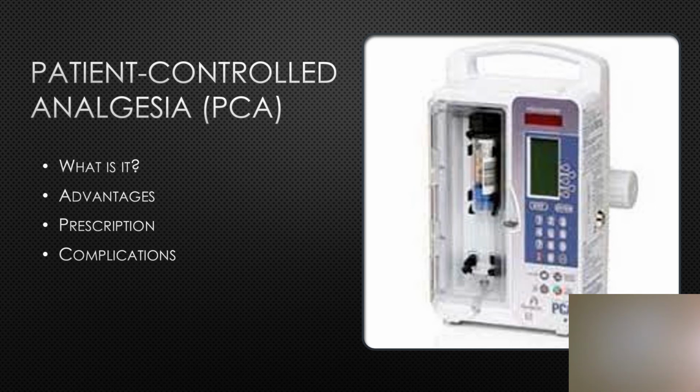The client should be the only one to control the button that delivers the analgesia. However, at times the nurse may need to help do that. That may also include an authorized agent-controlled analgesia administrator if a client is unable to do it themselves. And that can be a nurse, a parent, or a caregiver.